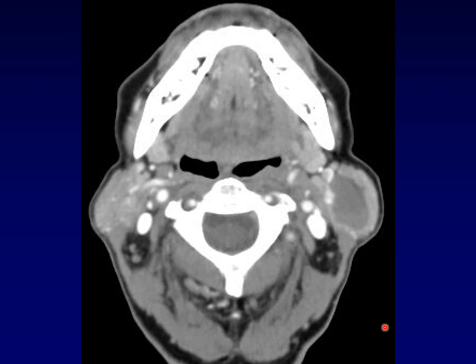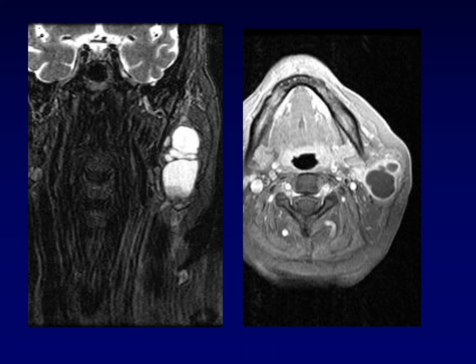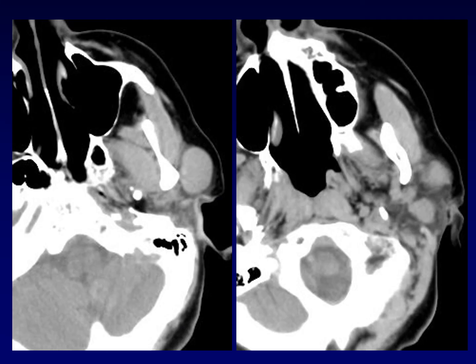Here is an example of a Warthin's tumor within the superficial lobe of the left parotid. Notice that it is essentially non-enhancing, reflective of that cystic degeneration. Here's another Warthin's tumor that has become superinfected — you can see not only an enhancing rim but also edema in the surrounding tissues. On T2-weighted images it appears bright but not as bright as CSF, because it is cystic in nature. Here's an example of a Warthin's tumor demonstrating multifocality, with three lesions in the superficial lobe.